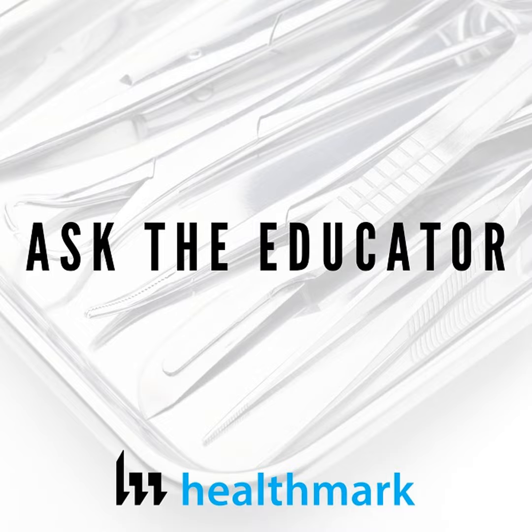Right. This is a major issue. The reason we're bringing it up again is because we haven't done one in 3 or 4 years almost on shavers. And this continues to be a problem in the industry, to the point where, like you said, I think it's like 100% of the facilities that we look at, we find some issue when we look inside the shavers. And that's just an insane number. It can be a little bit frustrating sometimes, because even, like I mentioned, the facilities we go in that have the borescope or the tools in place to actually inspect their work and then course correct because of that, and yet we're still seeing the dirty shaver.